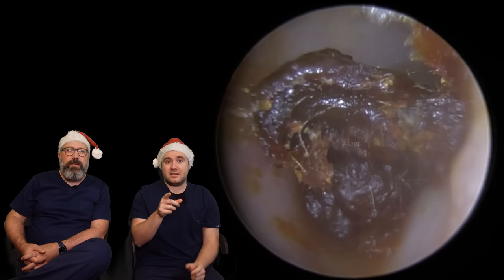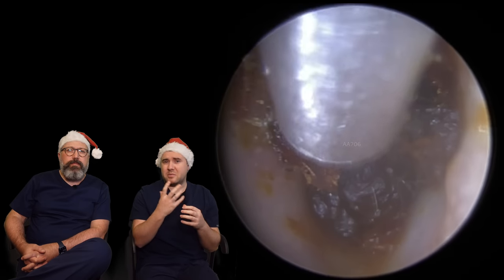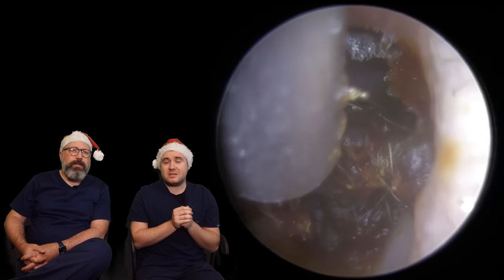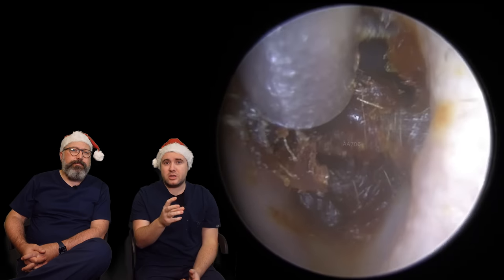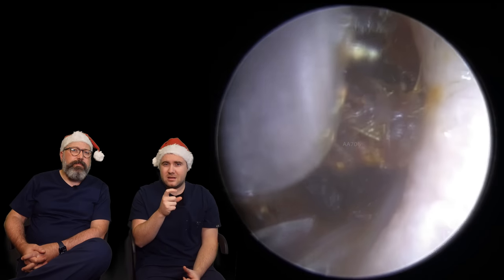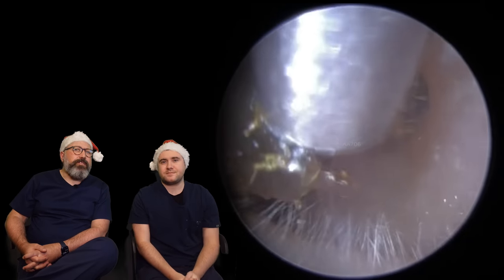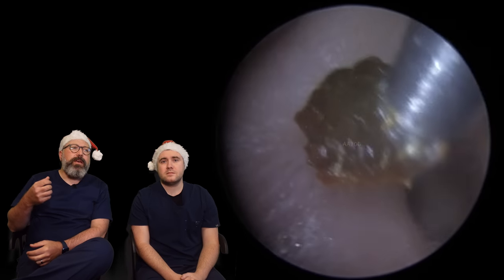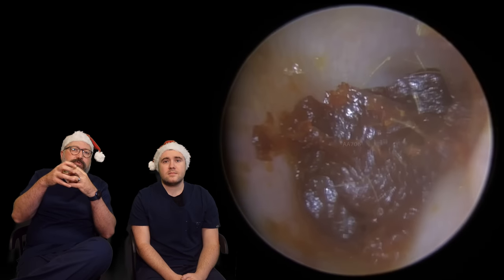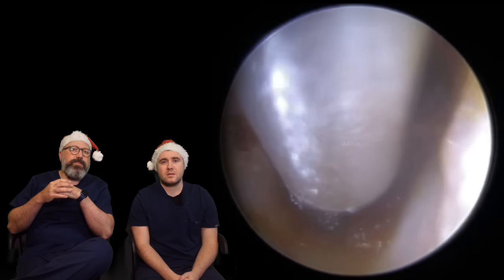It's really, really sticky old stuff. Now, this is actually the better of the two ears hearing-wise. The patient mentioned that she didn't actually believe there was any problem with this side, quite surprisingly. There is a standard size on the tube that we're using here, just to try and loosen this piece away. And it's going to break away that top section — I've got a bit unlucky there. That's the difficulty when you have these really thick, stickier type wax. They do naturally want to bind together, but there's not a great deal of structure to it, so they will pull apart and tease apart quite easily.